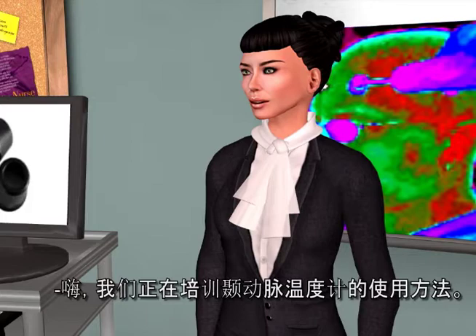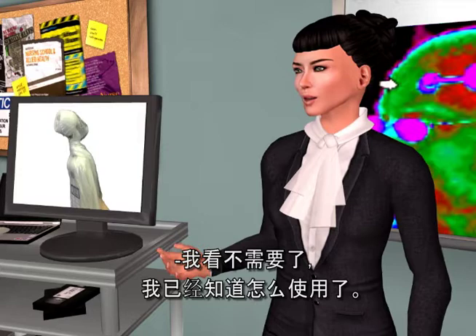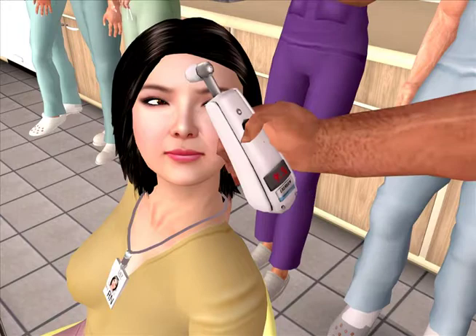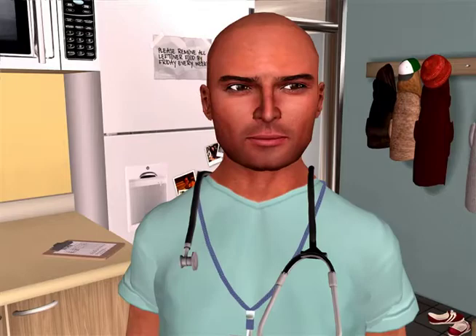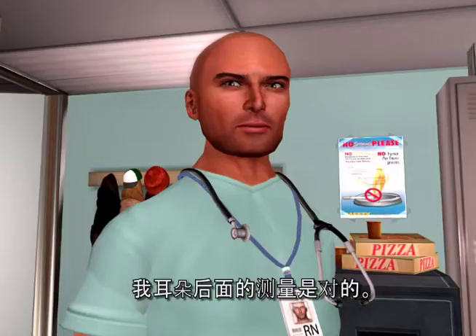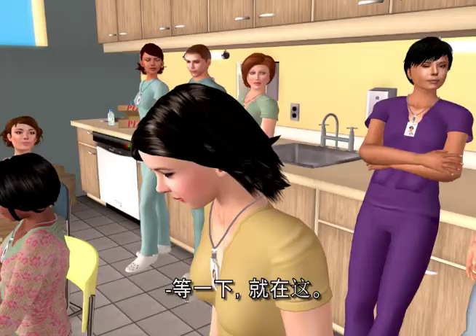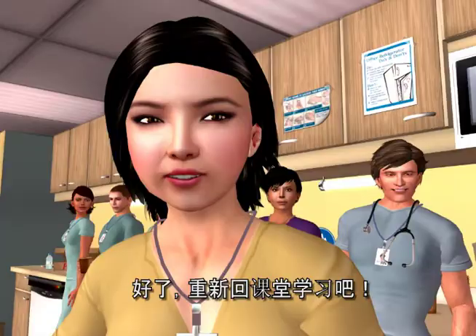We're having an in-service for the temporal scanner thermometer. Will you join us? No, I already know how to use it. Would you just quickly demonstrate for me before you leave? Well, you got it half right — the part behind the ear. Okay, back to school, Smarty.